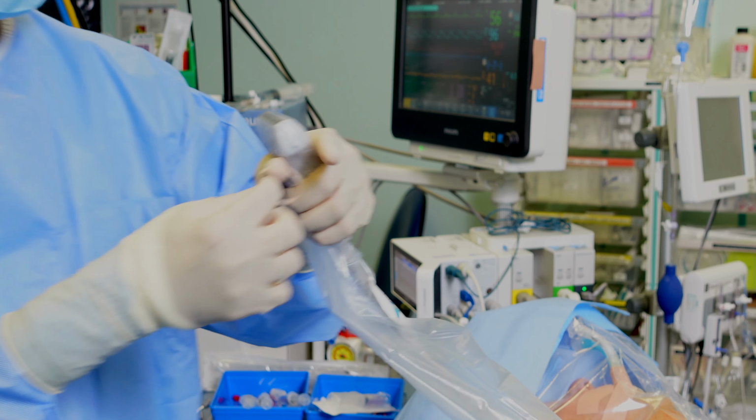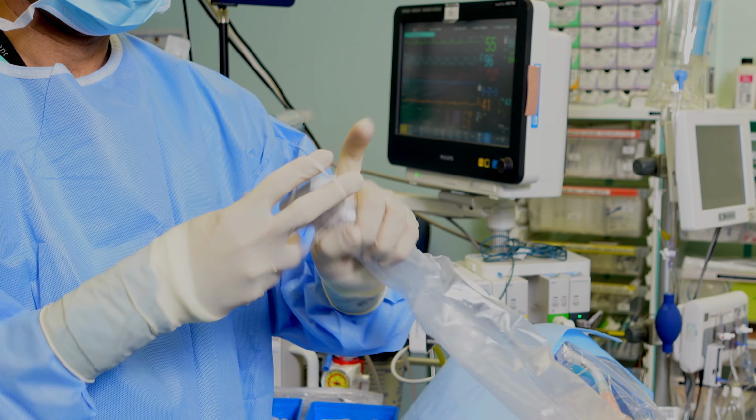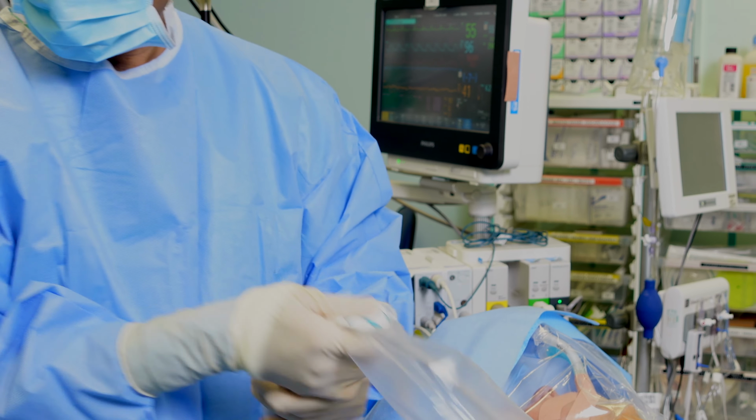You've got the transducer, now what? Gel. You can never have too much gel. During a pre-scan, non-sterile gel is fine, but always use probe covers and sterile, sealed, single-use gel for the moments where skin will be punctured.